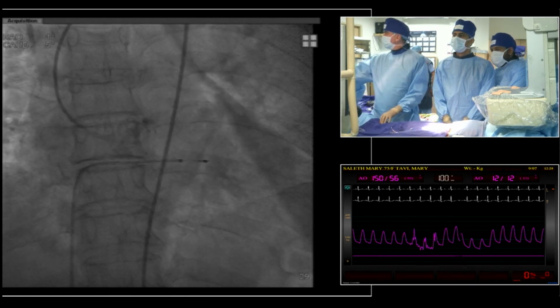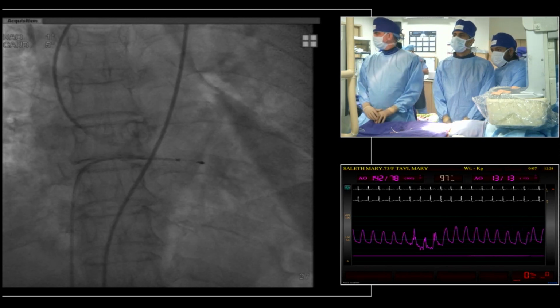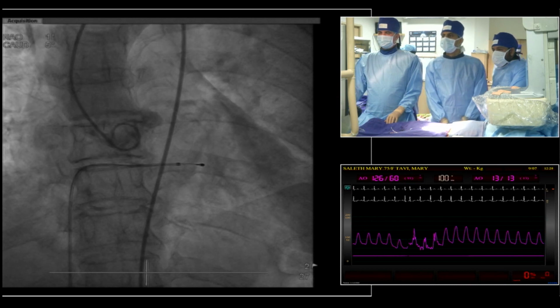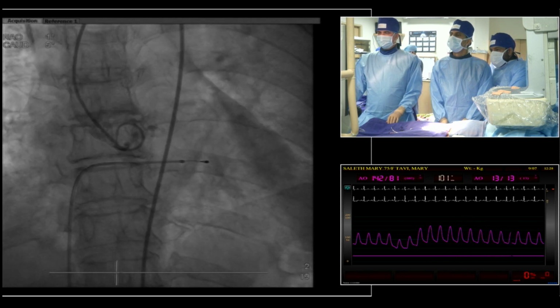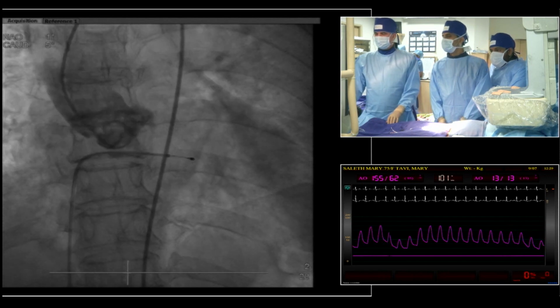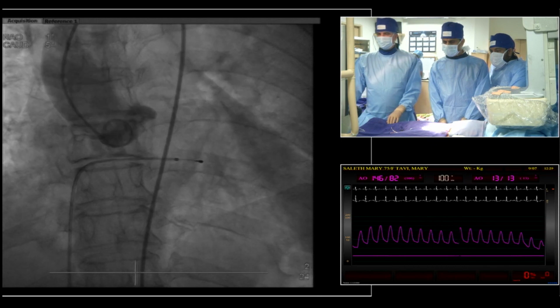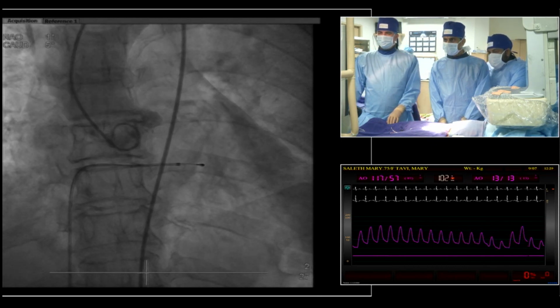Go back, could you please show the aortogram. In TAVI, we need to make sure that we can see a very good coplanar view, with the cusps in line, at the same level. Can you play it, and then we can freeze it later? Dr. Sengo, could you please explain the direction for this patient? Are you happy with this projection?